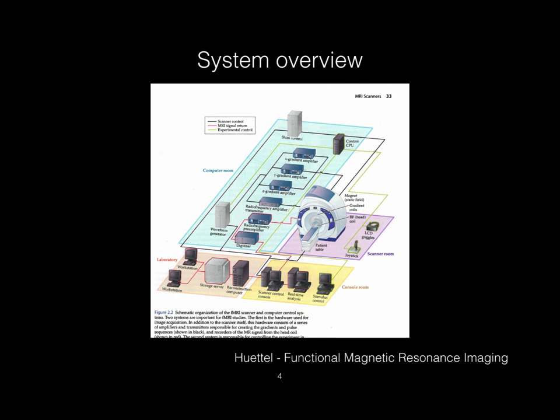And around that, very closely, there's a very substantial electronics bay. This provides a lot of the support equipment that drives the scanner, that drives the experiments. So for the first portions of the lecture, besides the magnet, we want to be concerned about the RF subsystem, the radio frequency subsystem.